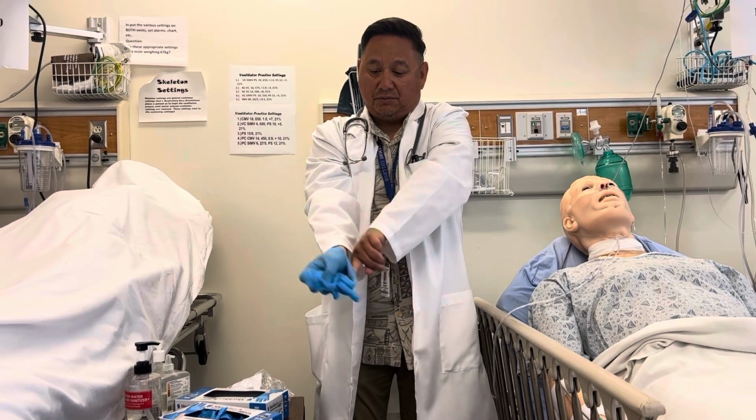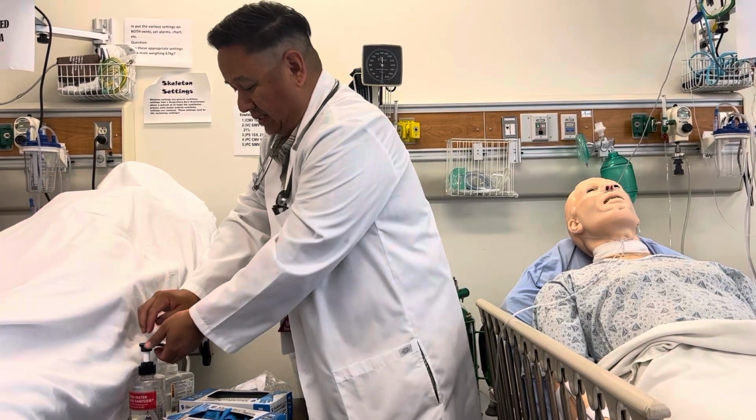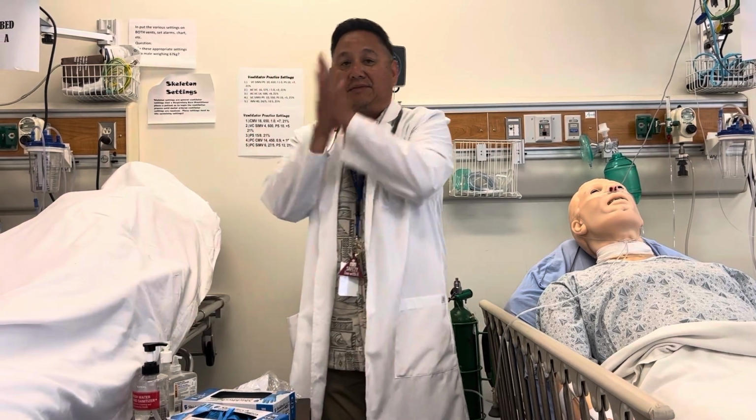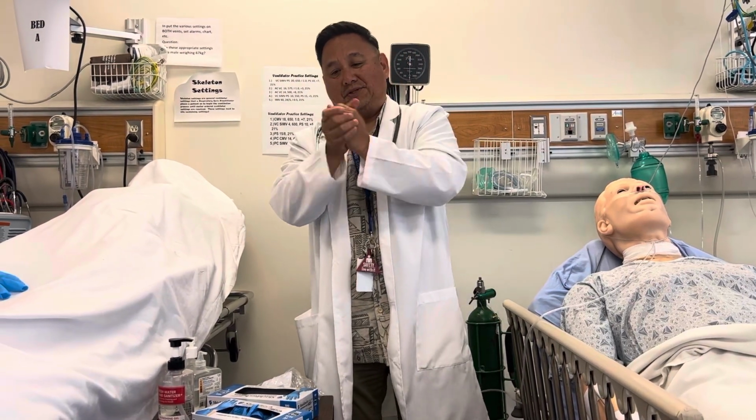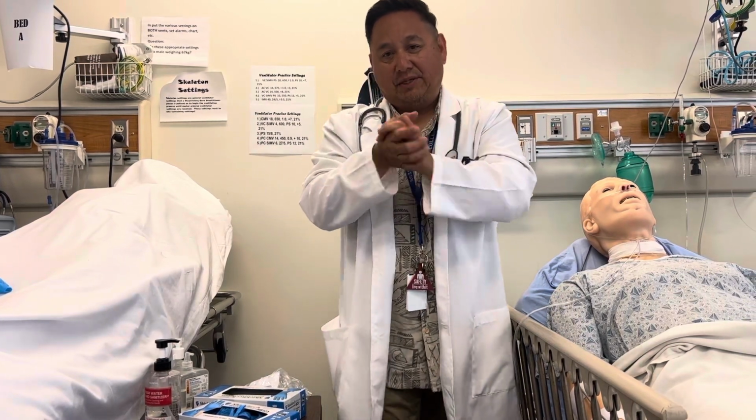take off my gloves appropriately. Put them in the wastebasket. Take another 3 mL of sanitizer. Dry for at least 15 seconds or until dry. And then I will exit the room.